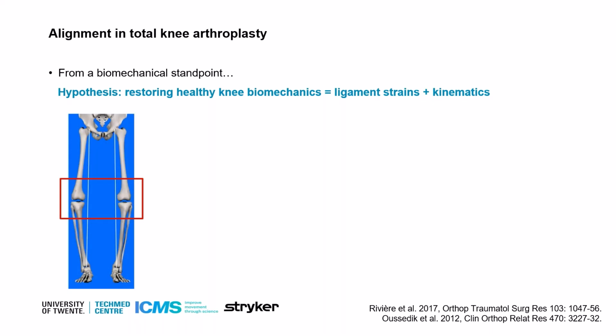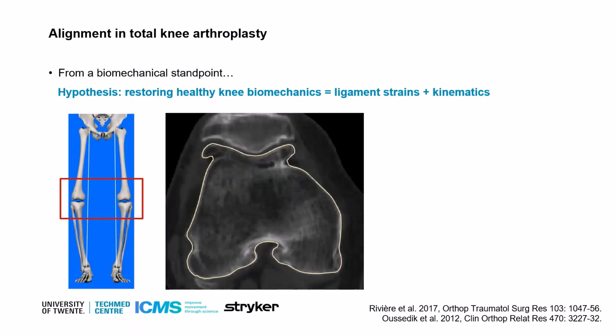And in this work, we focused on the knee joint. And if we scan the osteoarthritic knee, we could see that there are morphological changes to the bones due to the osteophytes. And the osteophytes could consecutively affect the biomechanics and ultimately our target, right? Hence, the question that arises here is whether we can indeed utilize the pre-operative imaging or whether we should consider regenerating the pre-disease state of the knee bones without the osteophytes toward achieving our goal.